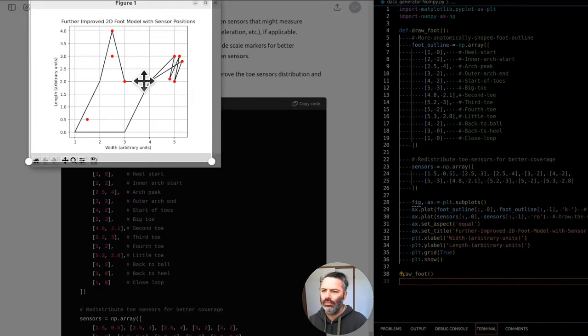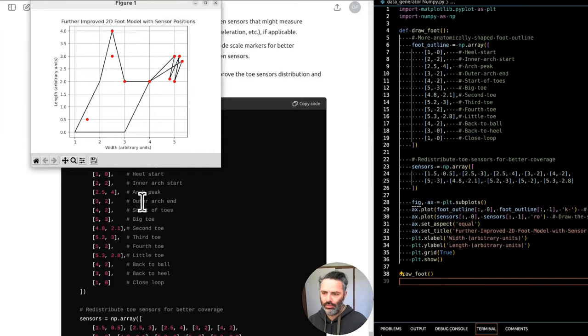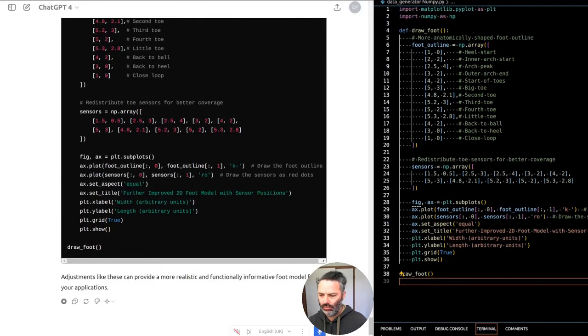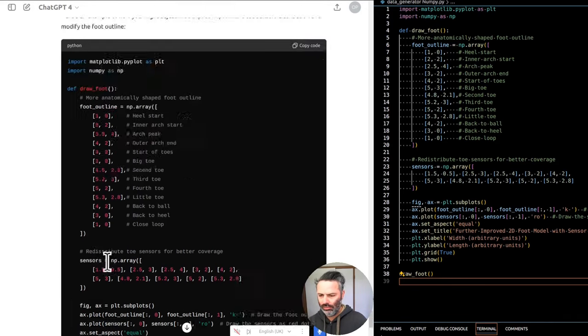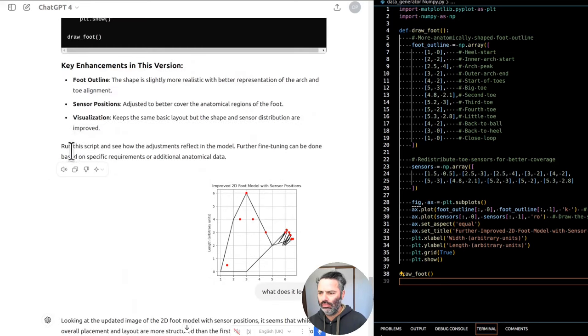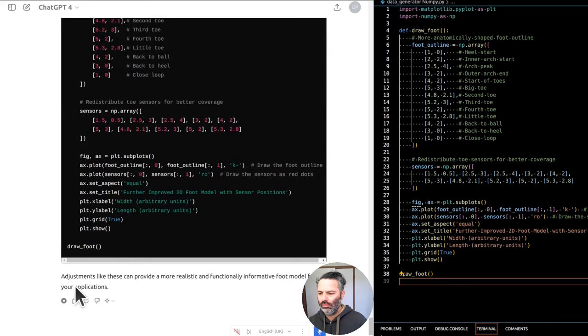Observations and suggestions for further refinement. 1. Toe area. The sensors on the toes are still quite clustered, which might not effectively represent the pressure variations across different toes during a gait cycle. Consider spacing these sensors more distinctly across each toe.